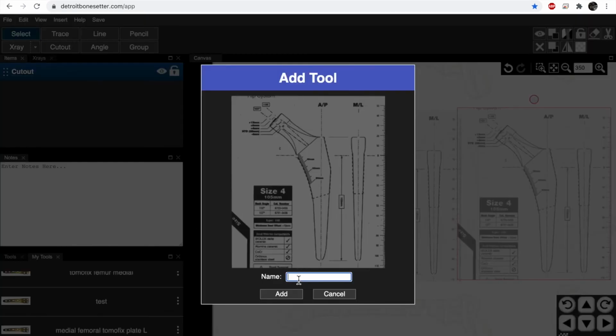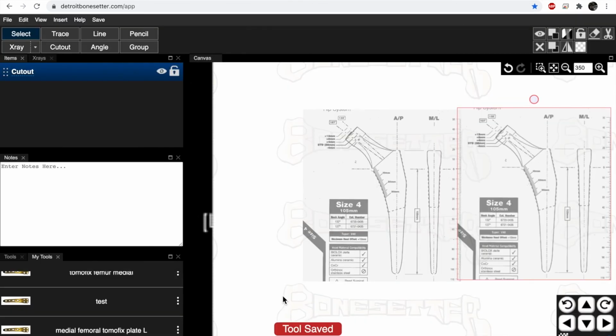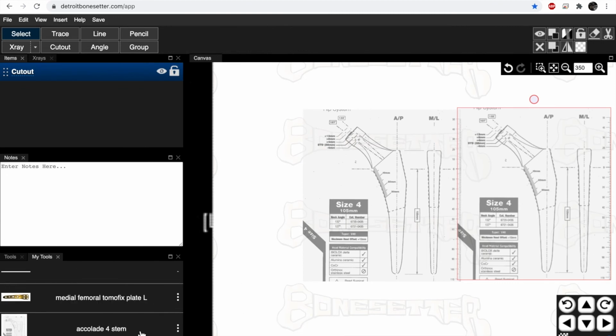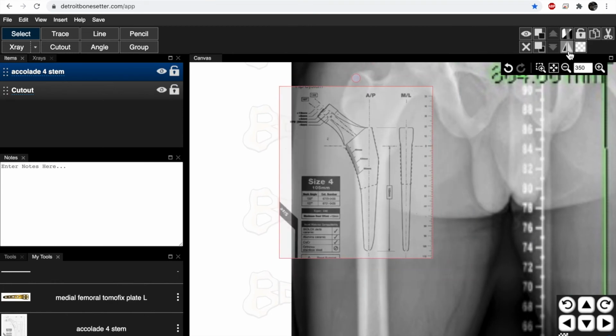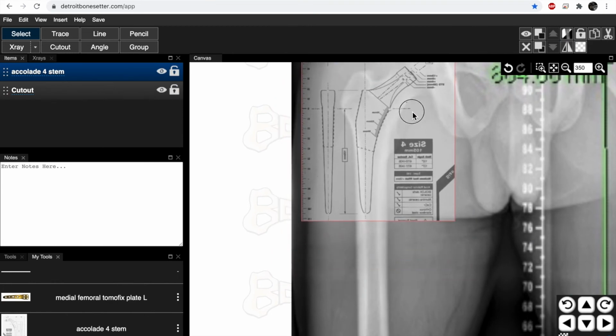And then I would say maybe this is an Accolade size 4 stem, and add. And now that says tool saved. So now if I want to use it anytime, it comes up and there's my number 4 stem. And you're going to have to save different ones.